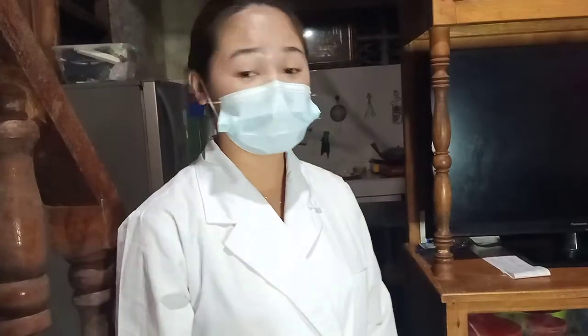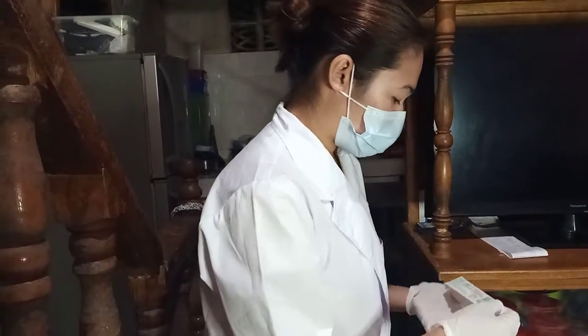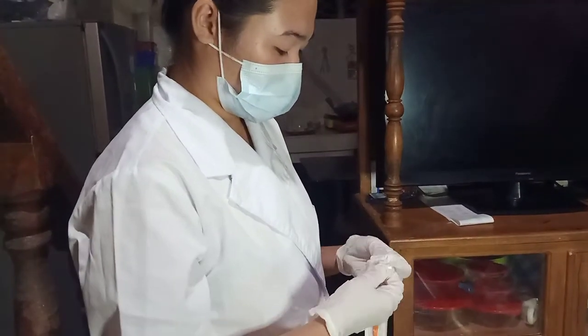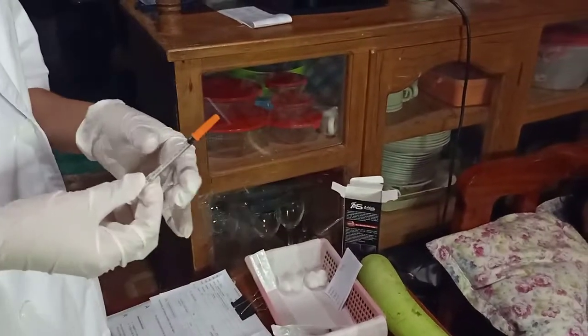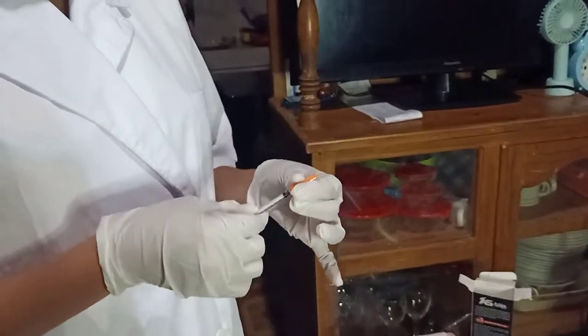First is to prepare the medication and the equipment needed for the subcutaneous injection. We have the insulin syringe.